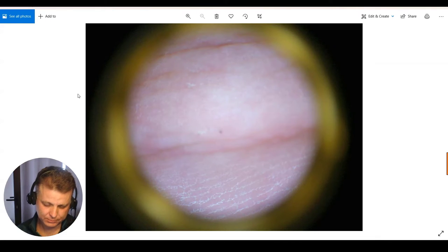I've got a couple of photos here from when I was using a DL100. If you know about the lineup, it's pretty much one of the most basic dermoscopes available now, but it is a 10x. If you've ever seen the Lumios, which are 4x, they work so well and they have a huge lens. But whereas typically I'm more open-minded about using a lower magnification because of how nice everything looks with a Lumios, for scabies I do think you pretty much need to stick to 10x. The majority of dermatoscopes are 10x anyway — you kind of have to look at one of the less common models to find anything lower.